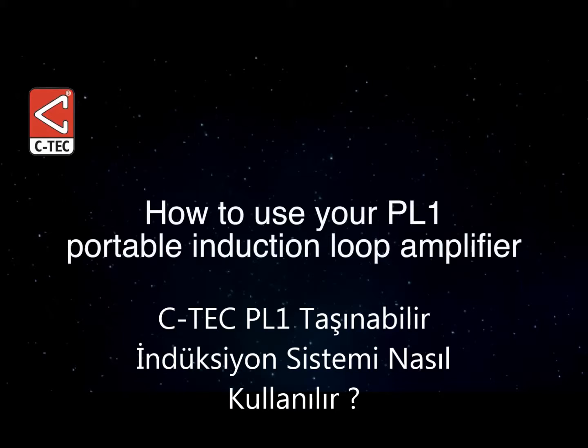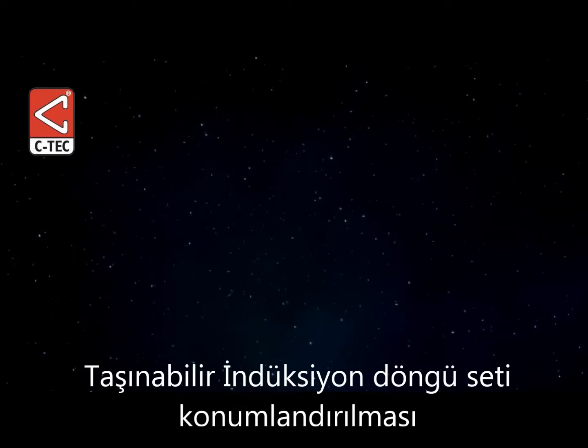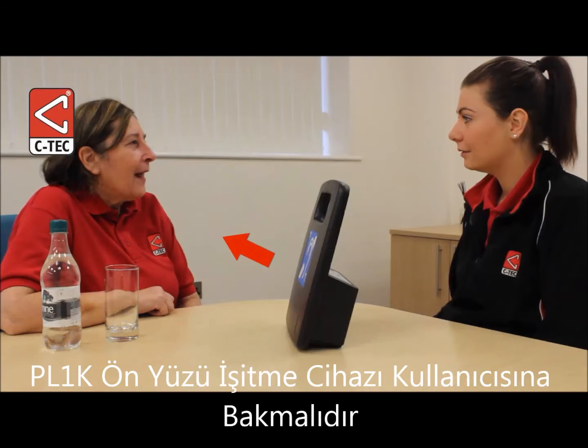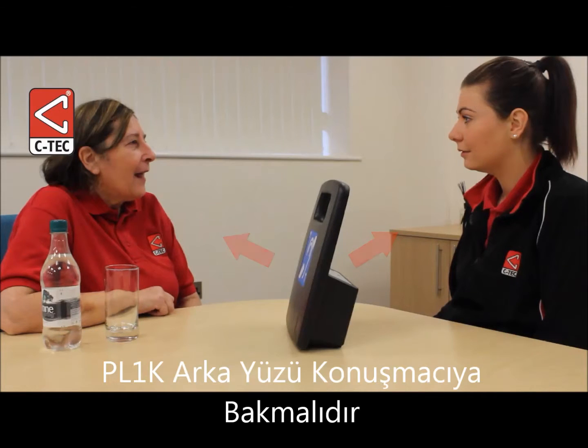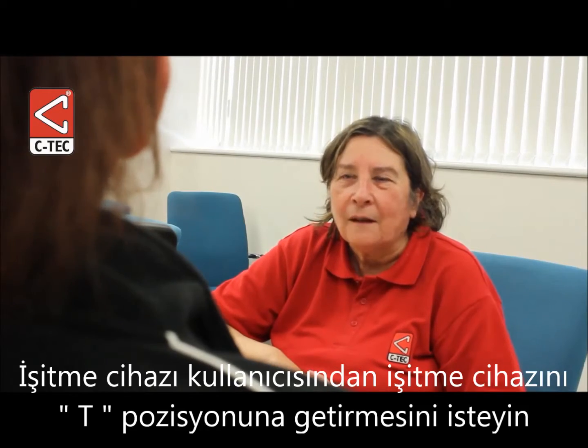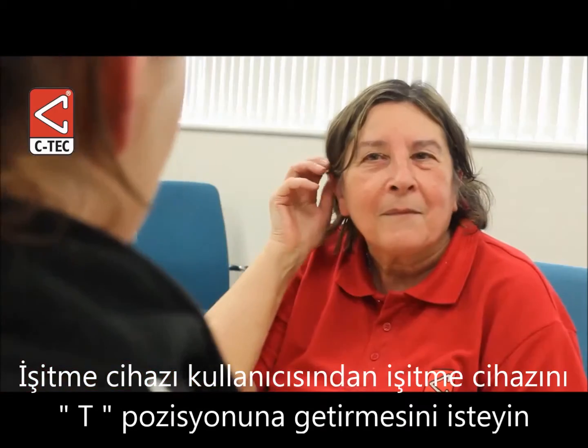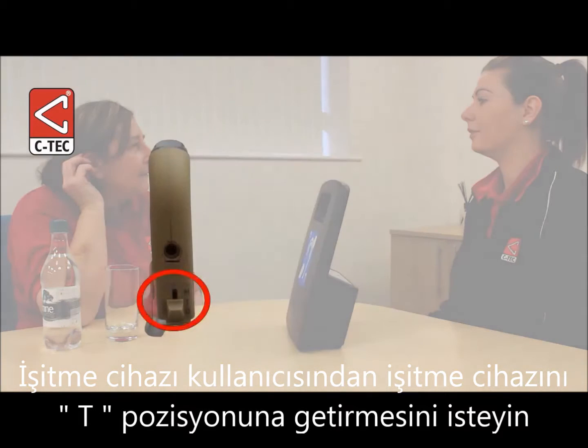How to use your PL1 amplifier. Position the fully charged amplifier so its front is angled towards the hearing aid user and its back is facing you. If the hearing aid user is in a wheelchair, take care not to block their view. Ask the hearing aid user to switch their hearing aid to the T position.